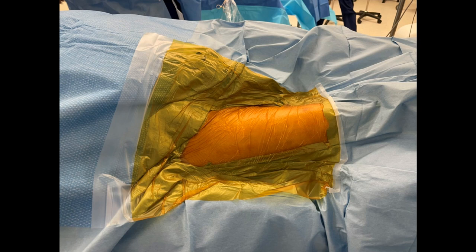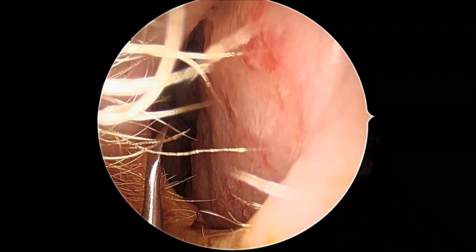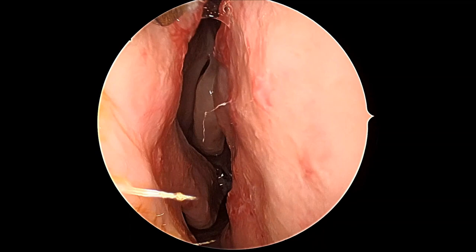Although an uncommon procedure, septodermoplasty is an important technique for a rhinologist. The right thigh is prepped, and in this patient the telangiectasia can be seen. Conservative treatments are tried first, such as coblation and ointments, but when bleeding becomes unstable or the benefit of such interventions is less than six months, a septodermoplasty is offered.